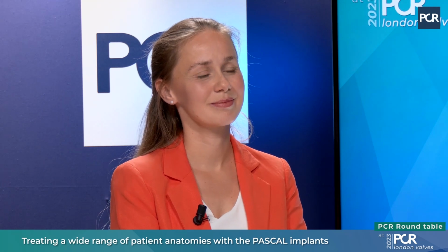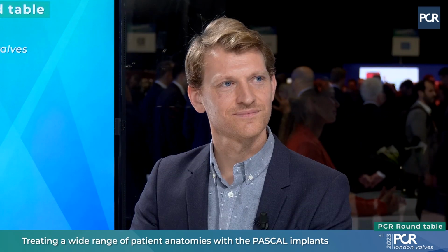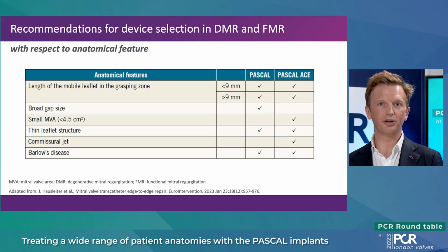I'm delighted to be joined by Mirjam from Heart Center Freiburg and by Niklas Schofer from Heart and Vascular Center Hamburg. We're talking today about the PASCAL device. The PASCAL is a transcatheter edge-to-edge repair device that comes in two iterations, the narrower ACE and the broader P10. Jörg Hausschleiter has published in the area of device selection, how to tailor the device to the patient's individual anatomy, and I wanted to talk through some of these features today.